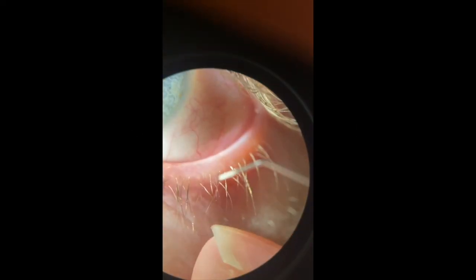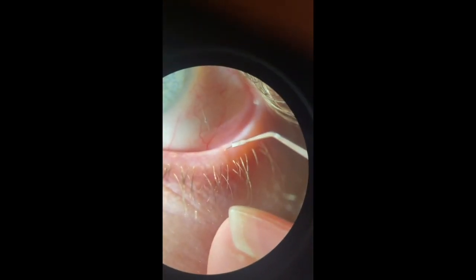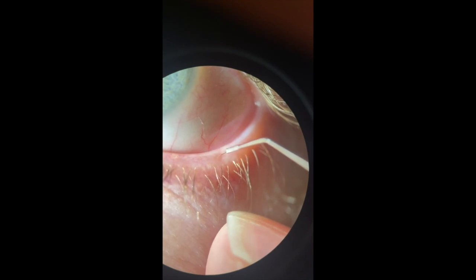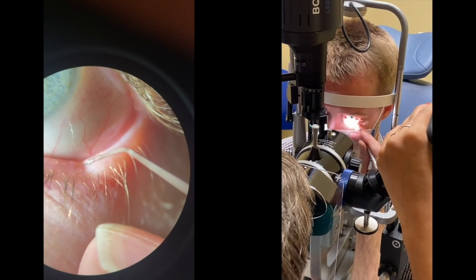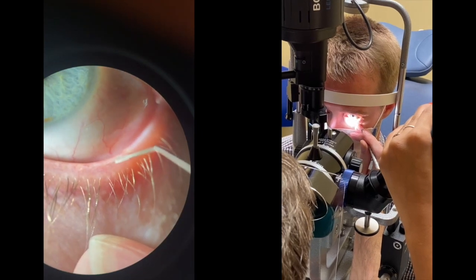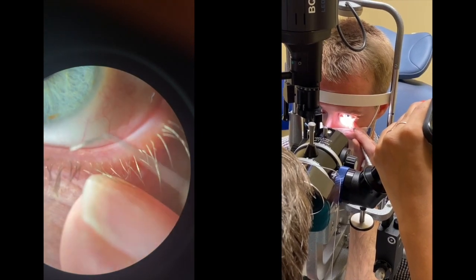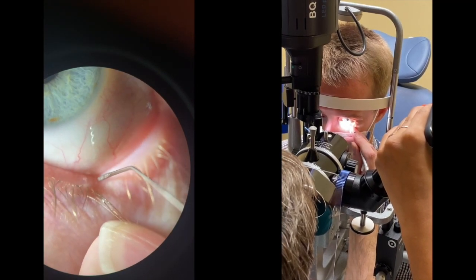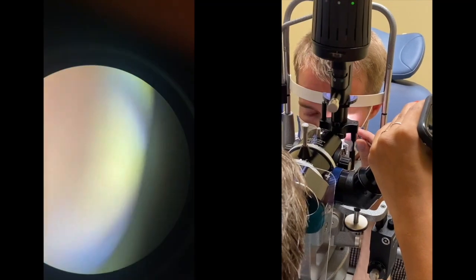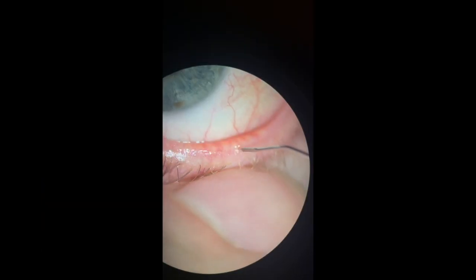The left lower lid, again in a similar fashion, the lid is everted and each meibomian gland opening is entered. Another way to stabilize the lid besides a finger is to use the meibomian gland expressor, because the two-point fixation can lead to more stability and also allow you to better and more firmly open up the plugged meibomian glands.